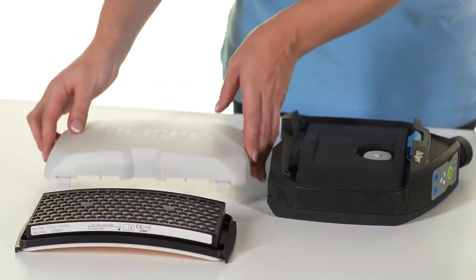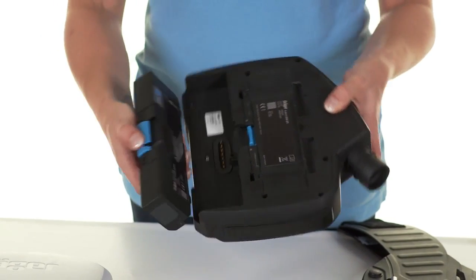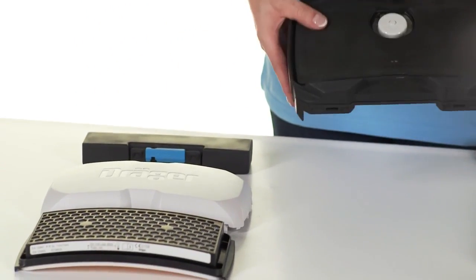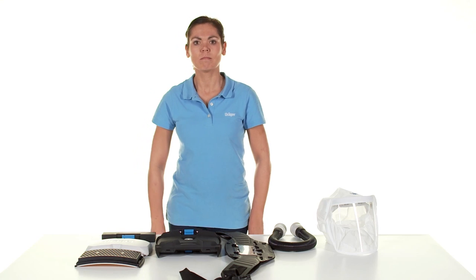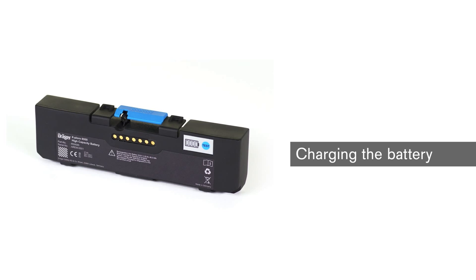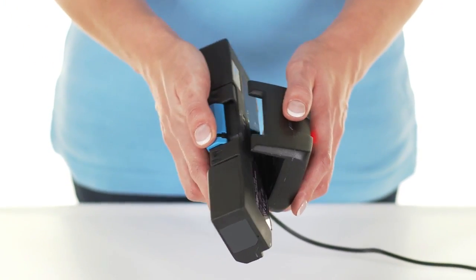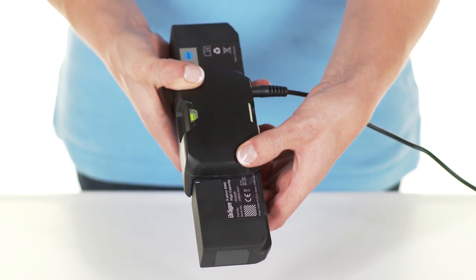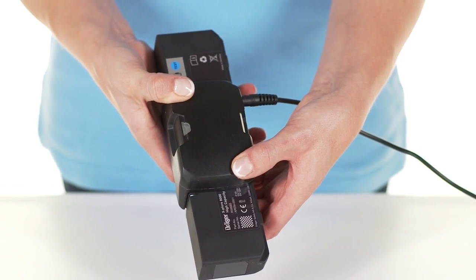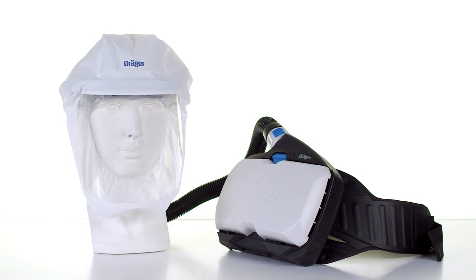The filter must be disposed of properly after use. Insert the battery into the charger and plug in the power adapter — charging takes up to 4 hours. Now you have learned how to handle the Explore 8000 Powered Air Purifying System correctly. You can start your mission.